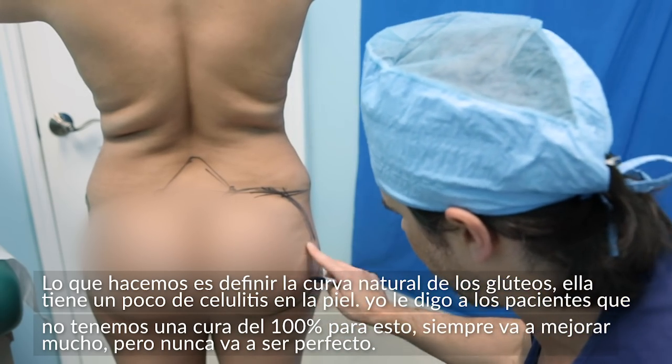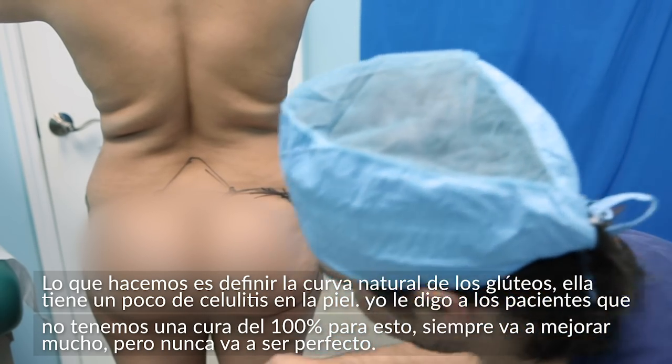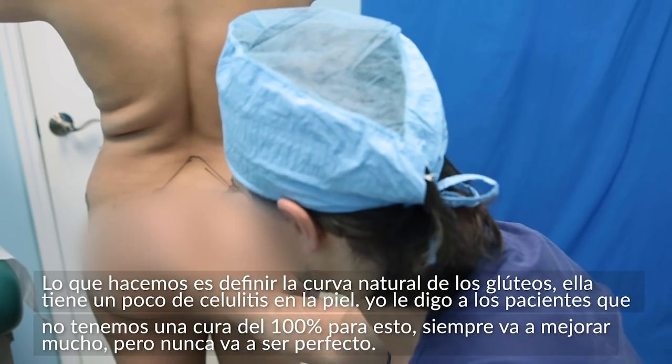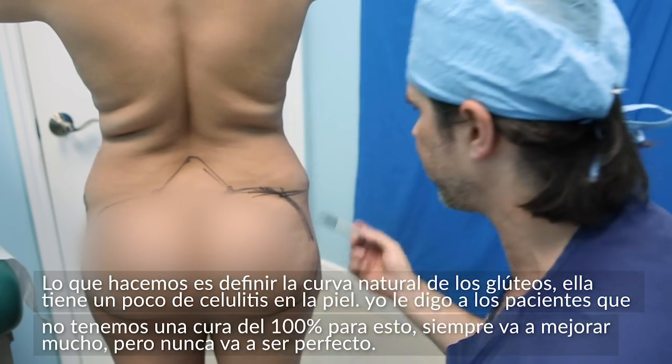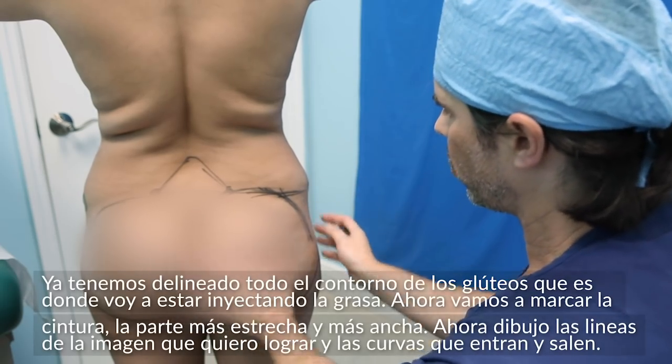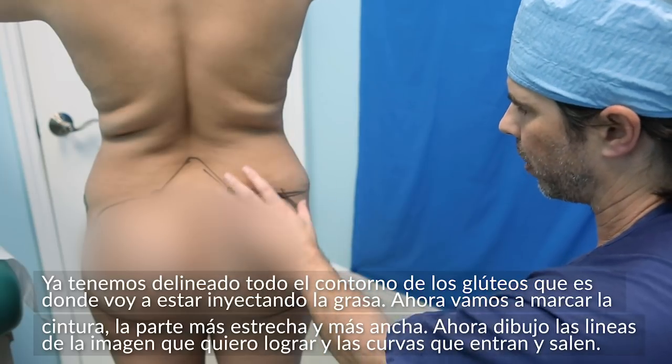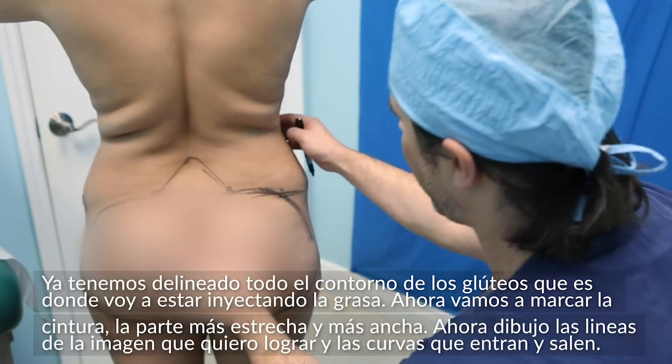She has a little bit of cellulite on the skin over here. I always tell patients we don't have a hundred percent cure for cellulite — it'll always be better, it'll never be perfect. Right now I've defined the outer outlines of the buttocks, which is where I'm going to be contemplating injecting the fat.